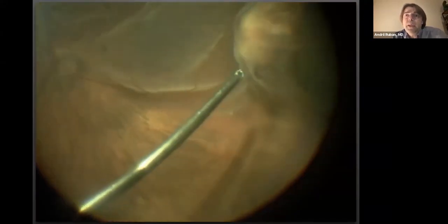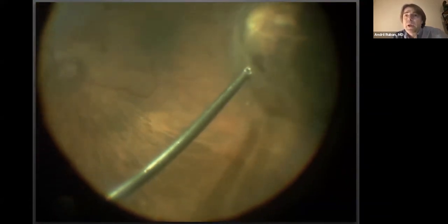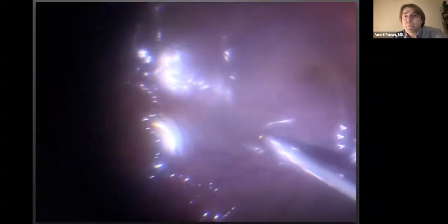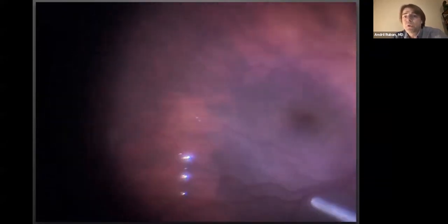As usual, a primary break can be used for internal drainage of subretinal fluid. But with peripheral breaks, residual subretinal fluid in the macular area can occur. I don't like to leave a significant amount of fluid in the macula, especially with gas tamponade, as I would not like to get a macular fold after surgery. In such cases, a posterior drainage retinotomy is required. It can be initiated by using an endocutter or a 41-gauge subretinal cannula without diathermy.